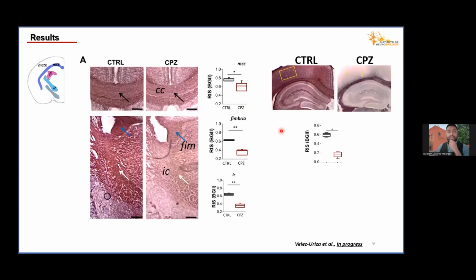However, when we analyze the brain cortex, we observe that there is also a demyelination caused by cuprizone in brain cortex, and inclusive in the hippocampus. But in the case of cortex, this does not correlate with the diffusion MRI metrics. This protocol is useful for measuring demyelination in white matter mainly, while it should be improved for gray matter regions.